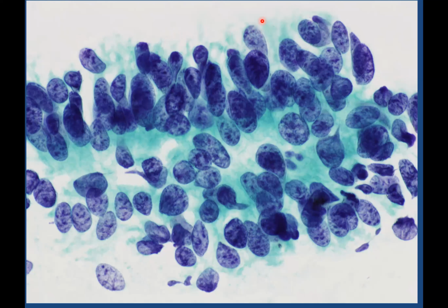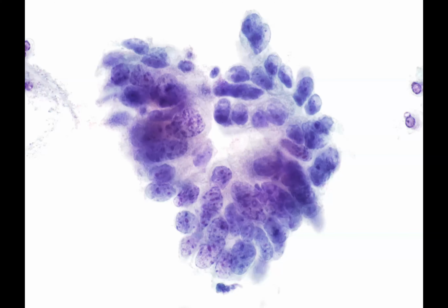This is where the endocervical cells have been pulled away from the basement membrane, and we've got little tags of cytoplasm, a bit like pulling a hair from your scalp, where the cells would have been attached to the endocervical basement membrane.